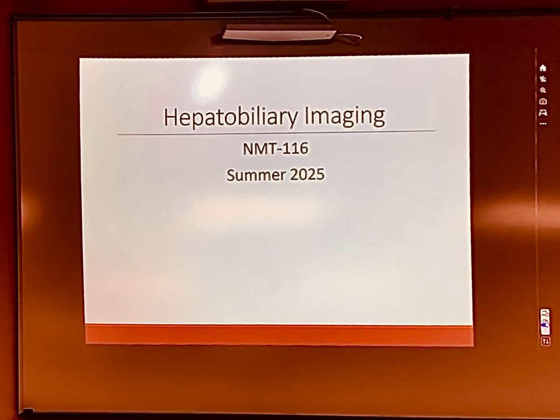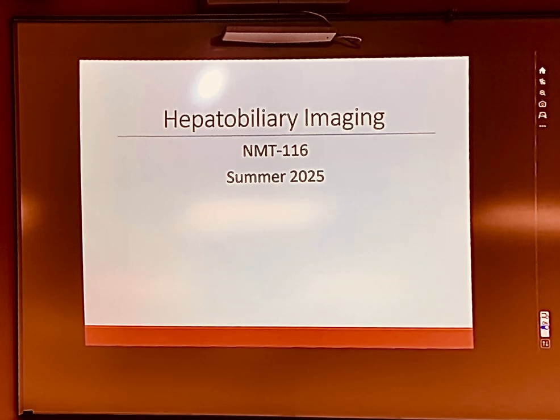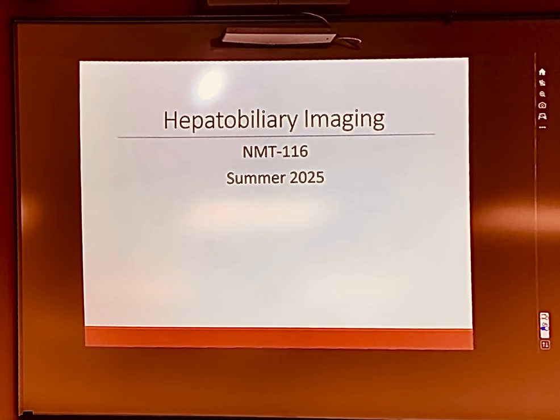Hepatobiliary just means the imaging sequence of the liver and the biliary tree, which is the internal hepatic plumbing. So we do two different kinds of liver imaging. Actually, we do a couple, but this is the most common. The second most common is called liver and spleen imaging. So we give two different drugs for that. Liver and spleen imaging, we give sulfur colloid for that one.